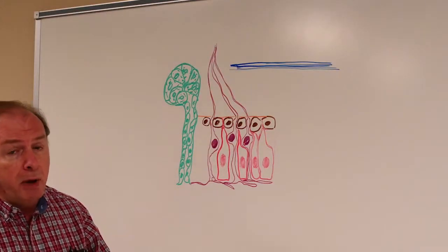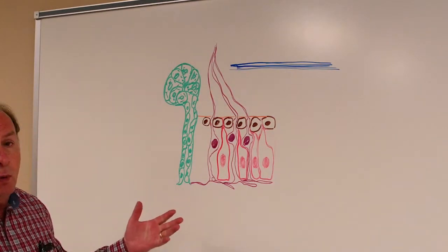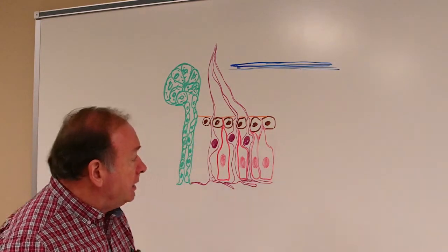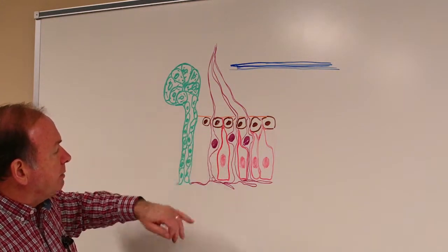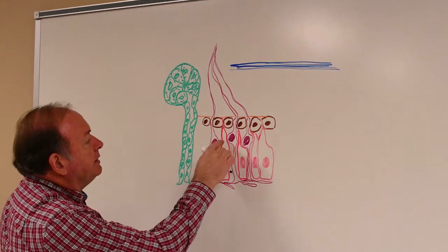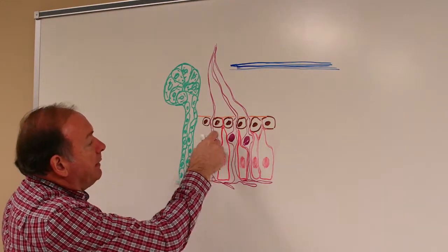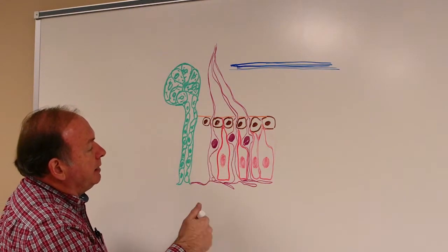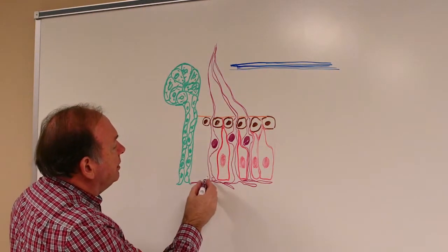Now to start our lab on respiratory tissues, we're looking at olfactory epithelium first. And this is kind of berry purple, raspberry color. Right here I have 3 cells with these nuclei. They widen out here, then get narrower, and then spread out down here. These are your olfactory cells.